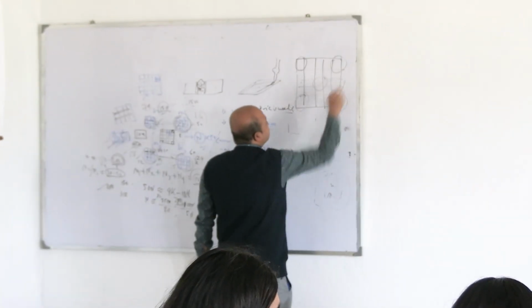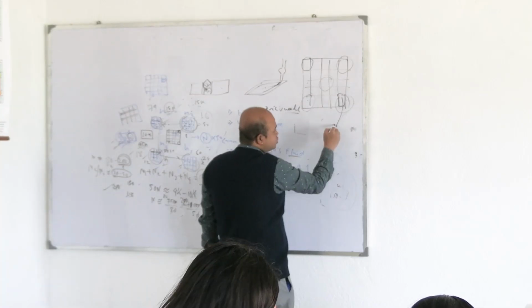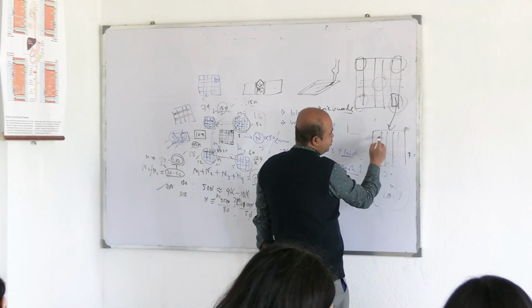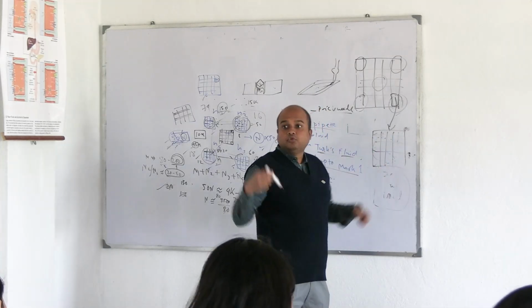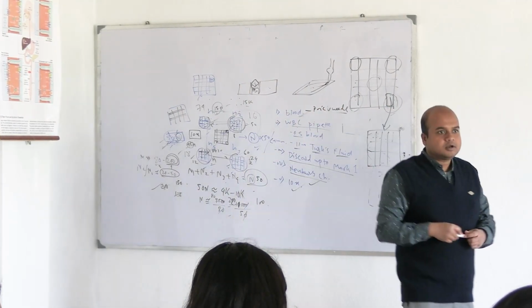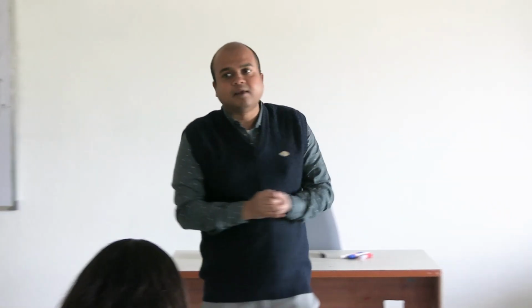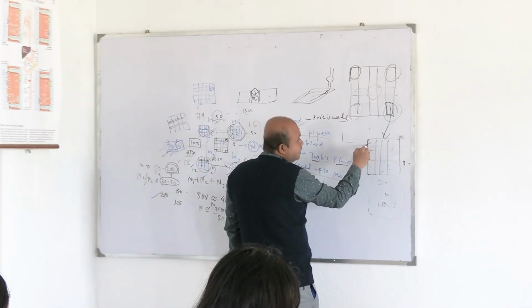Now if this is the large RBC square and each one of these 25 is medium, then each of these medium squares is divided into 4 into 4, by those triple lines which are between the RBC and the WBC squares in the other squares. Those triple lines contribute to this division. So that is 4 into 4. Actually RBC cells are more dense, much more in number than WBCs, so we are calculating it in this square.